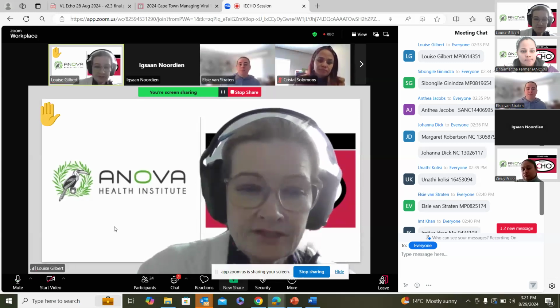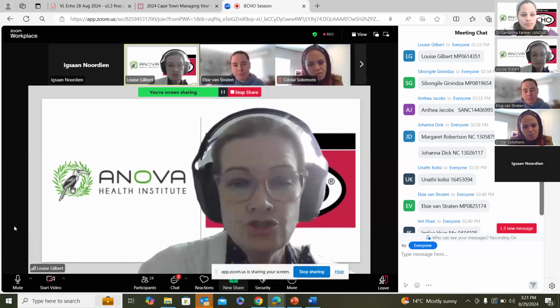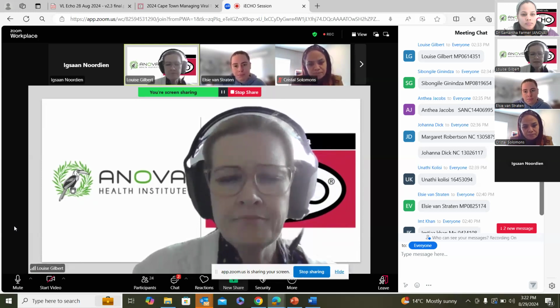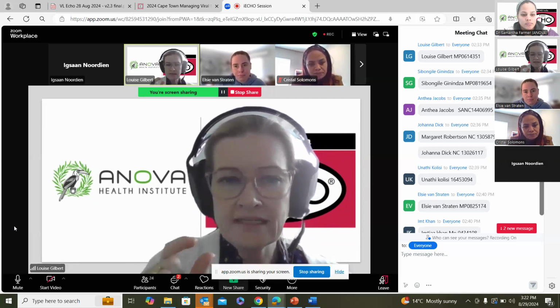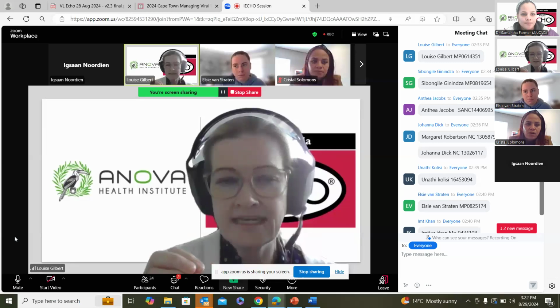So if I could just ask a follow-up, if we don't have microtainers, if we only have the normal sized tubes, which might not be such a huge problem in the Western Cape, I'm not sure, but I'm based in Johannesburg. Is there a way that the lab could still process the specimen, even though the amount of blood might be very small in a normal container? Do we have to alert the lab to that? Or is it a problem because of the amount of additive that's in the container that it can't be processed if there's only a very small amount of blood?